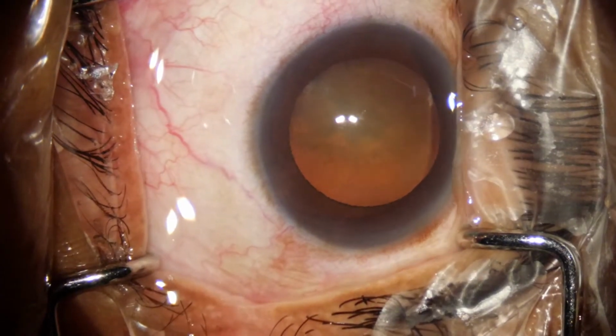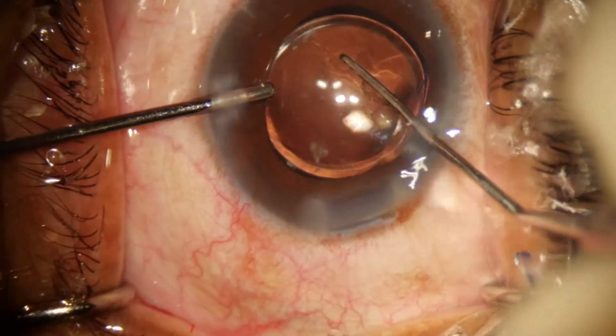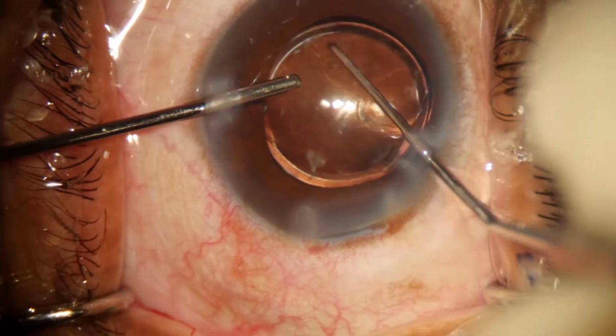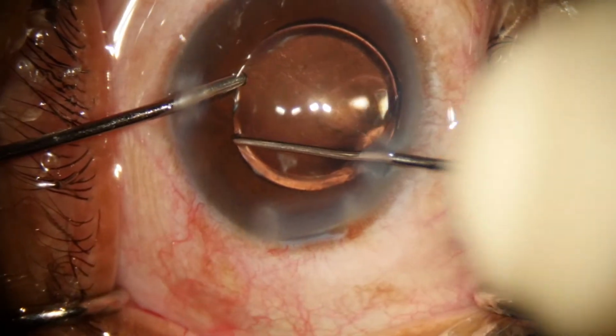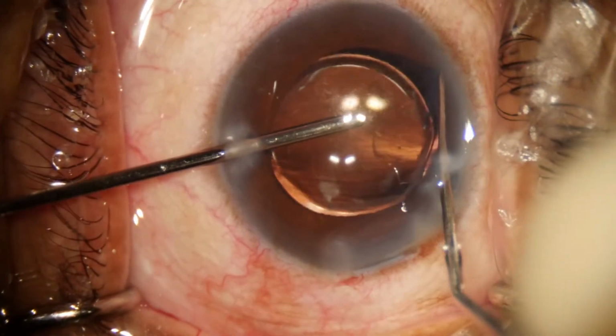In pseudoexfoliation syndrome, a three-piece IOL is implanted in the sulcus with optic capture by the anterior capsular rim. These two situations, particularly with retained OVD, are associated with increased risk of capsular bag distension.